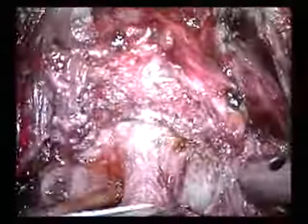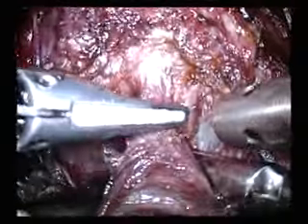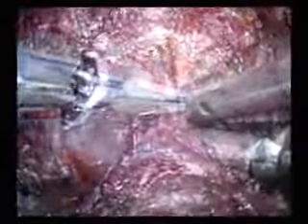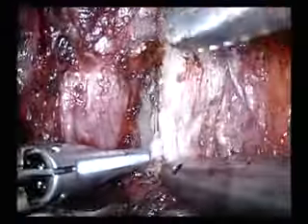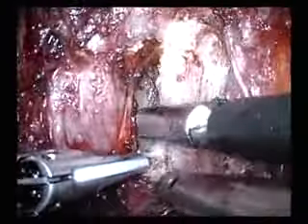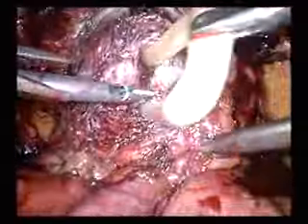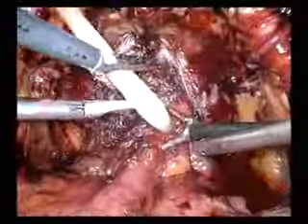In bladder neck sparing procedures, these longitudinal muscle fibers have to be carefully developed. When cutting the bladder neck, the assistant and the operator push the bladder dorsally. It is completely incised and the catheter is pulled out into the retropubic space and placed on traction. The dissection of the bladder neck is now continued laterally.